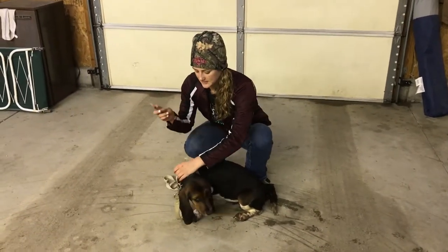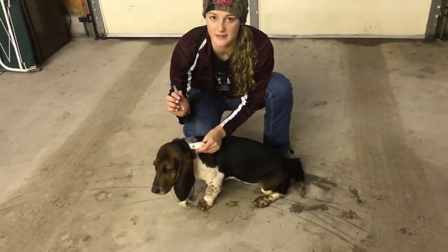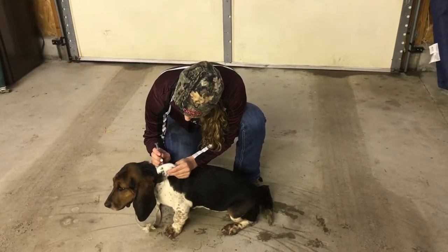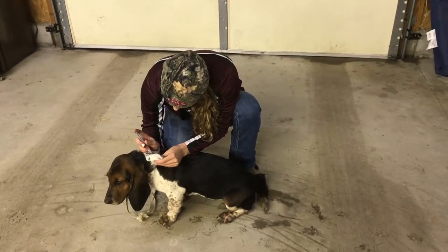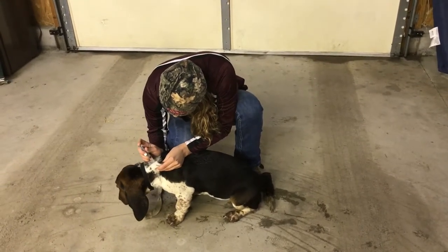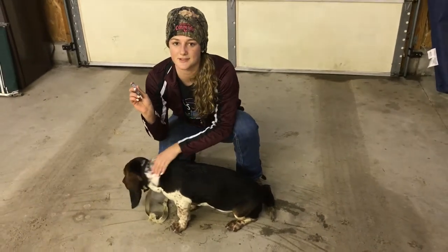First, you're going to want to grab the skin of the pup so it just goes right underneath the skin and out on the other side. Then you just put it right underneath the skin. Make sure you're not on the other side. Just push it in slowly, and then when you're all done, just rub it for like 30 seconds to relieve any pain.